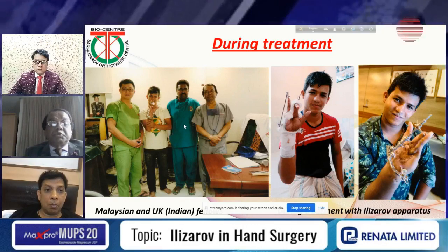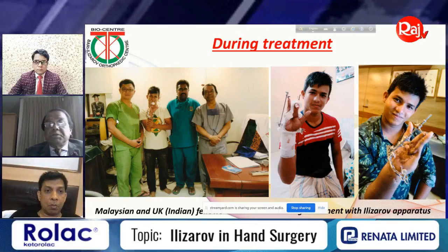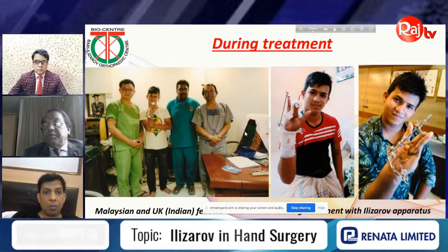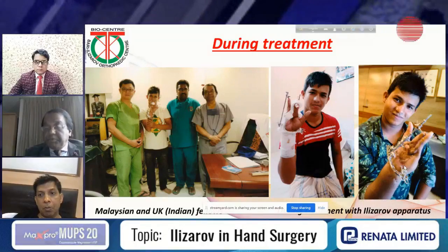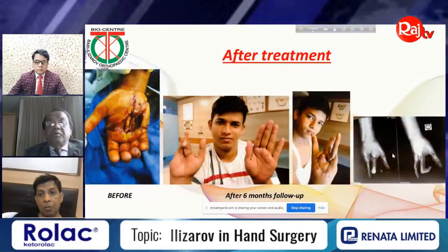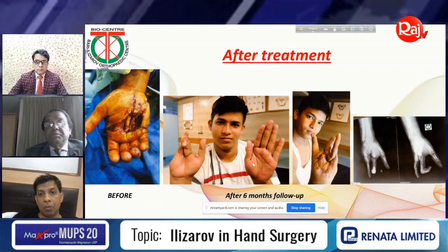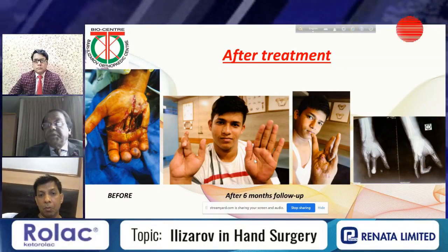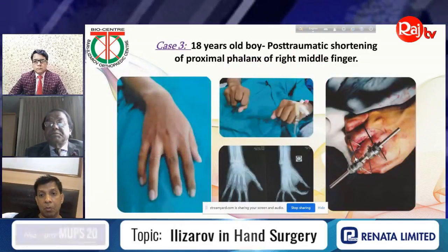He had a Bijobada. He was with me, and this fellow is from Malaysia. They did the fellowship here in my center, and this is the case with mini Ilizarov fixator. This boy came from Saudi Arabia for treatment like that, and he was like that. See, only 3 fingers, and then he could work with this.